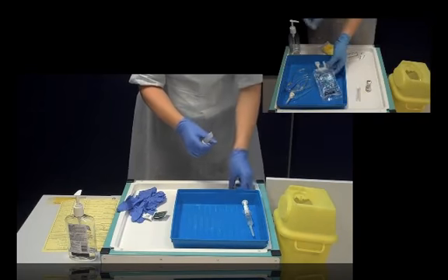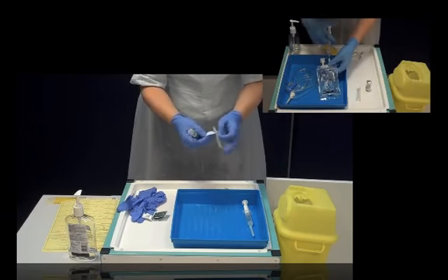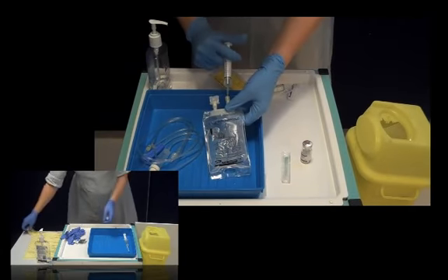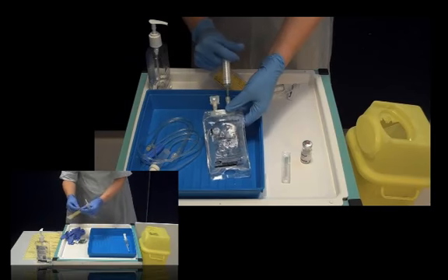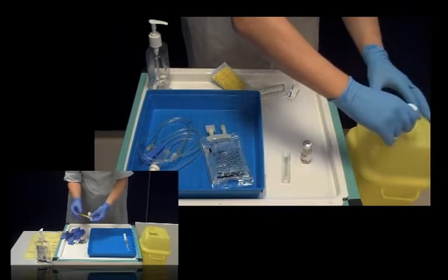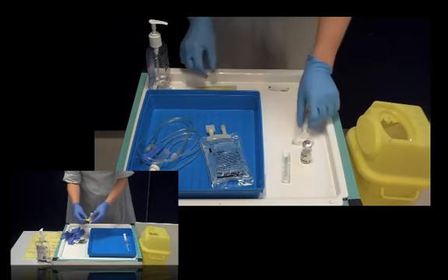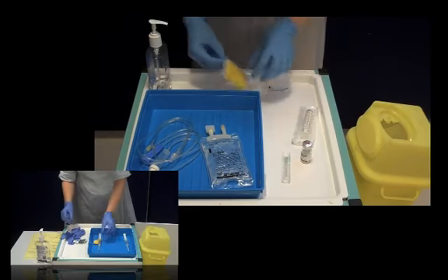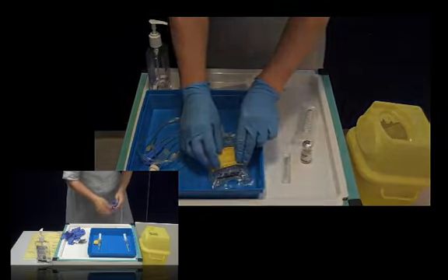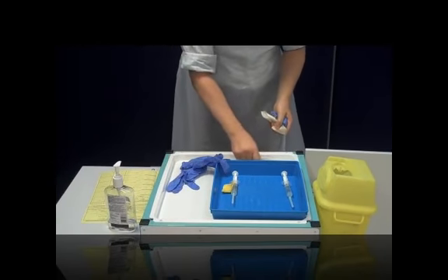To avoid confusion, attach a drug label to your syringe with your antibiotic in to let you know which is the antibiotic as opposed to the flush. However, if you're going to give the antibiotic by IV infusion, inject the antibiotic into the bag through the injection port and then run the bag through as described in setting up an IV infusion. Now remove your gloves, wash your hands and put on a clean pair of gloves.